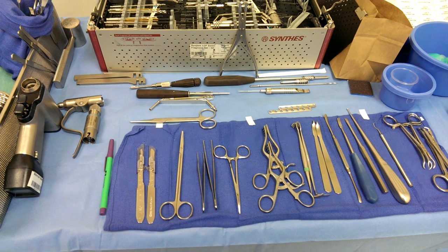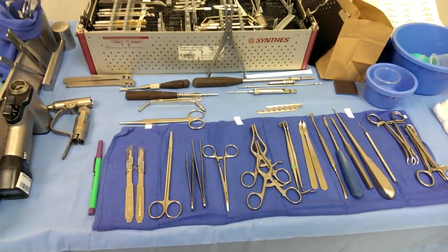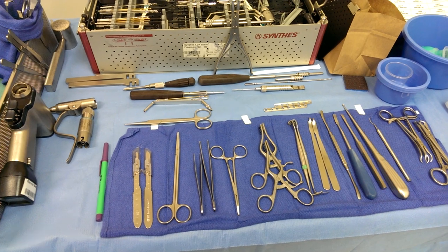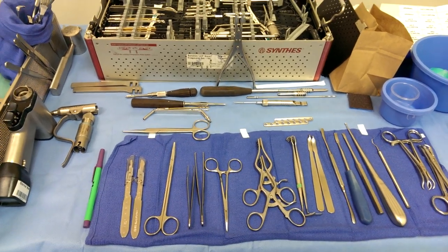The setup is basically set up on the back table. Most of the times they sit down to do this case, some of the times they stand up. So I usually just put it on the back table so they can reach for it, or we can both sit down and I'll pull the back table close to the foot of the table so we can access the ankle.